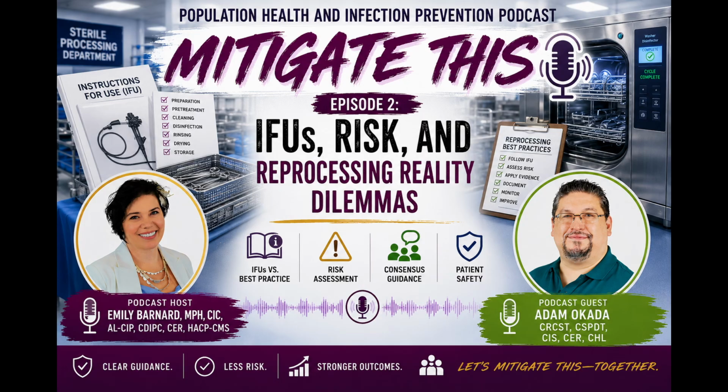I think I would defer to what the Joint Commission said. HealthMark actually did a webinar with the head of the Joint Commission Infection Control Committee. What she said is that the Joint Commission will look at regulations first, because regulations are laws that we have to follow, like OSHA and the bloodborne pathogens standard. Then they'll look at the instructions for use and the facility policies. All those things they look at first. They will not examine best practice standards until they are cited in a policy or procedure at the facility level. So keep in mind those standards, AAMI, AST, AORN, APIC, are consensus best practice standards.